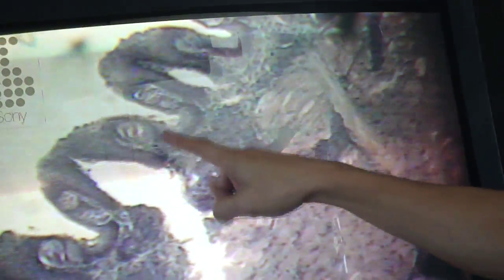Next slide is the tongue. This is a rabbit tongue, so you rarely see your circumvallate. So you see foliate, and this one are the taste buds. And you must know the different cells in the taste bud. And then these are the posterior glands of von Ebner. It is associated in humans with circumvallate papilla, but you could find them even in the foliate papilla.